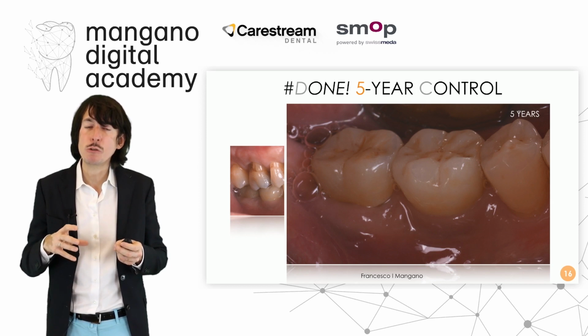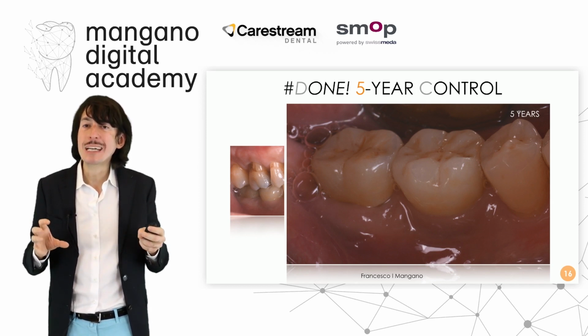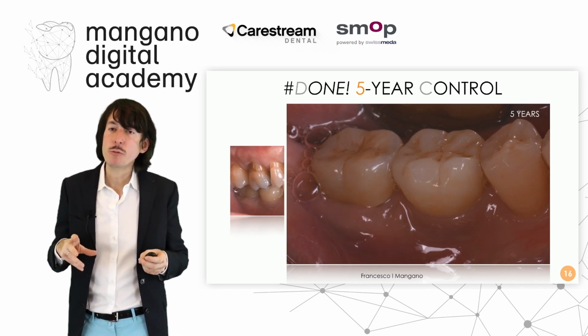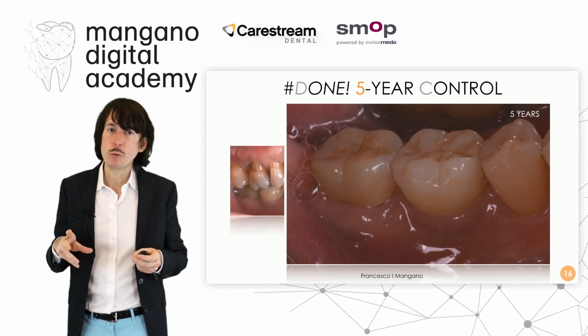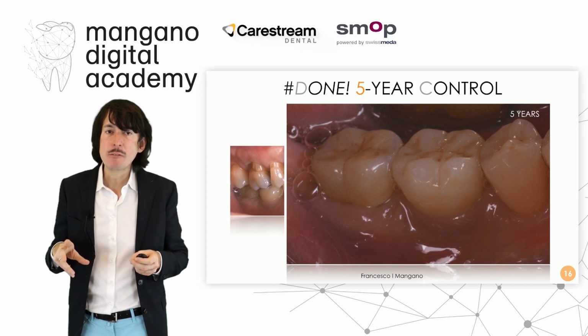And after years you can find a creeping effect with the tissues that are growing a little bit over the crown, and they close perfectly. It's an effect that is more difficult to see with the conventional metal ceramic crown, but in all cases we have seen this beautiful effect with the monolithic zirconia crown. With the monolithic translucent zirconia crown we have also solved the problem of the aesthetic quality, having anyway a very good mechanical reliability.